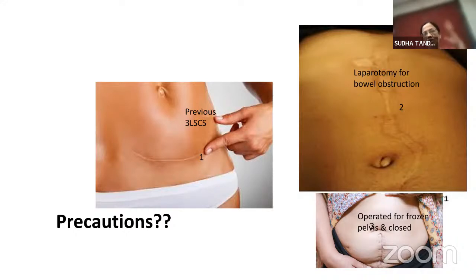Once you have raised it, it's not the volume of the CO2, but it's the pressure. And then you put your 10 mm trocar cannula. When you have a good pressure, it is very tense, so the damage is really less. So this is one way.